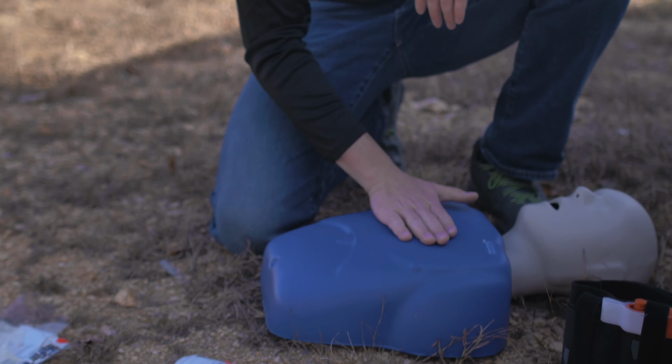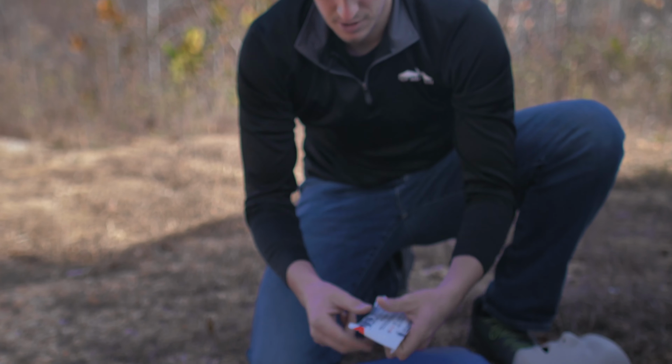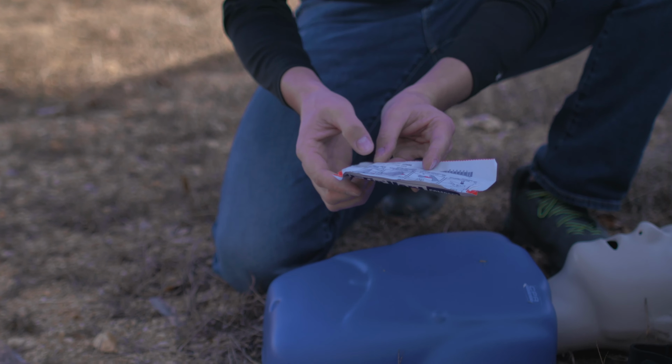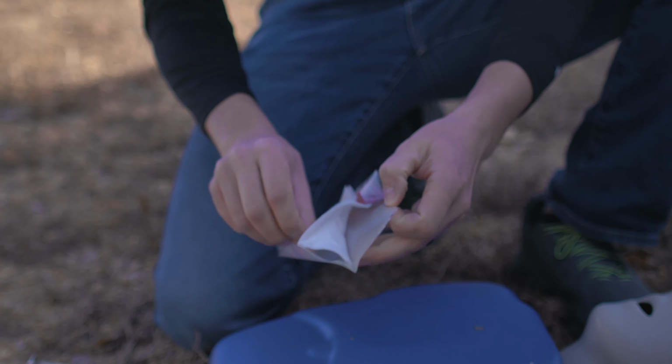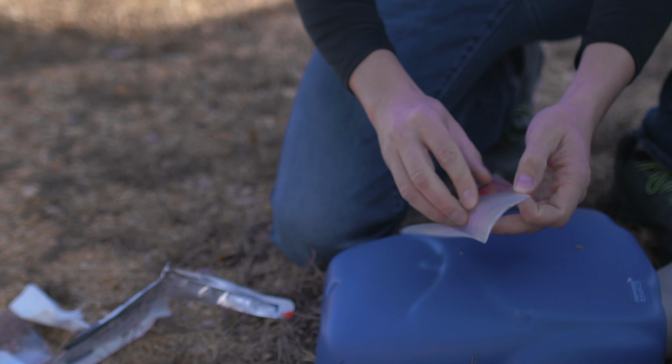All right, so this first one stuck well. It's cleaned off. There's no more sticky or residual from the previous one, so let's go with this next one. This next one is the one that is a year and a half old, 5/27 of 21, and has been inside a hot vehicle for one season. Open it up, looks the exact same as the brand new one. No issues there.